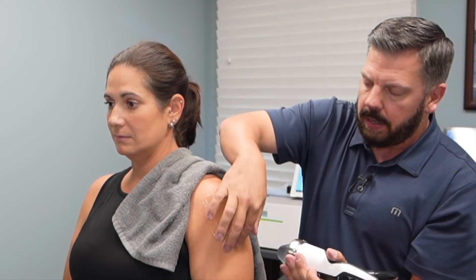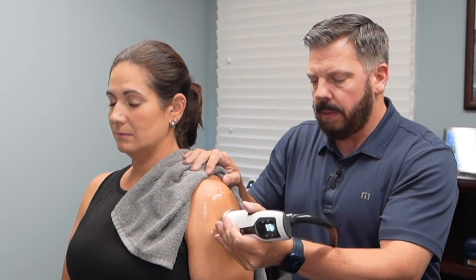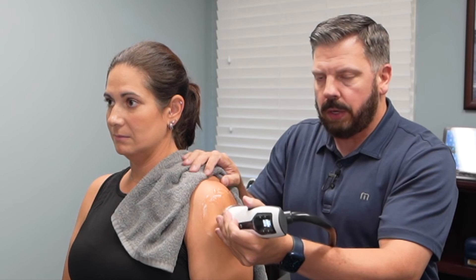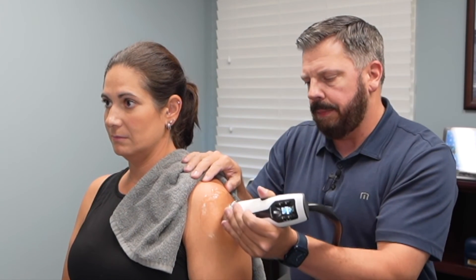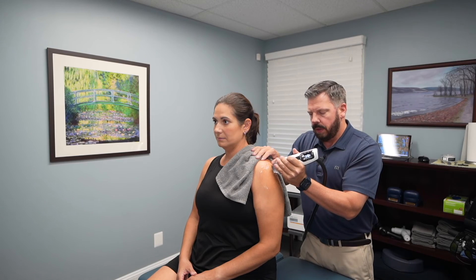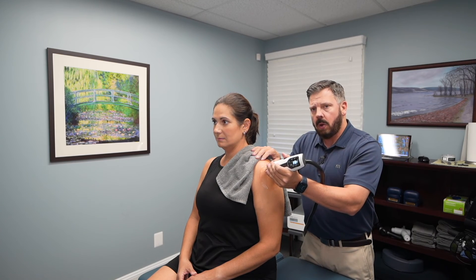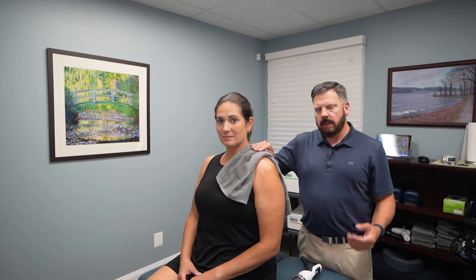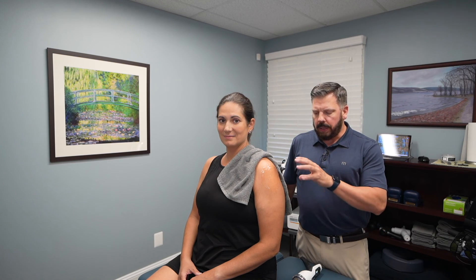Coming right off the bone, you can feel a lot of achiness when we get over the problem spot and even into the deltoid. People with frozen shoulder often have soreness all the way down into the lateral part of their shoulder because that muscle is working extra hard. The focus shockwave works really well in this area because it's pinpoint and can get very deep inside the joint to reach the shoulder capsule. With a typical case, we find those tender spots, hold on that spot, then move on to the next section, working all the way around the joint. When we're finished, patients will already notice range of motion improvement and a reduction in pain. Between radial and focused shockwave, I typically just use the focused when dealing with frozen shoulder. I also treat the trapezius muscle because compensating and leaning recruits neck muscles, causing neck pain alongside a frozen shoulder.